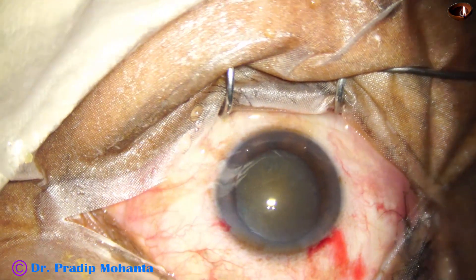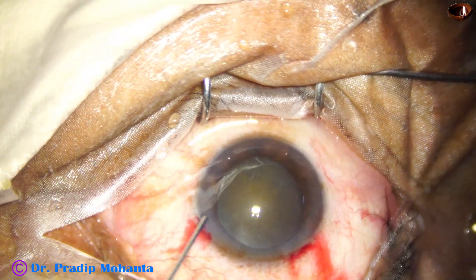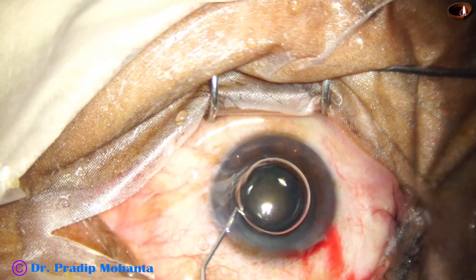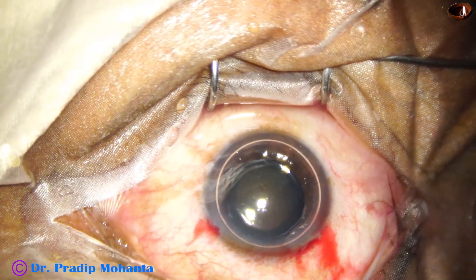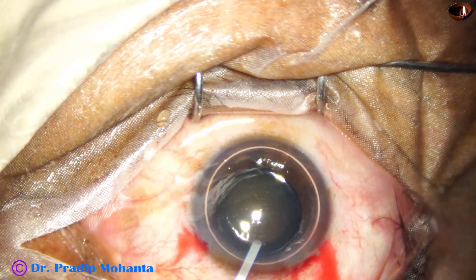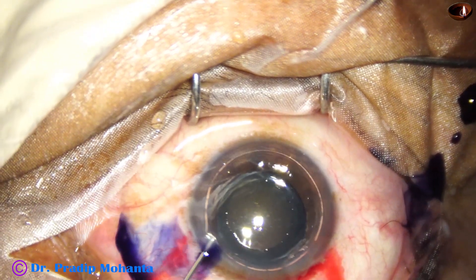An air bubble is injected. Beneath this air bubble, trypan blue dye is applied over the anterior capsule. If we apply the dye underneath an air bubble, the dye is not diluted by aqueous — staining is very fast and very quick.